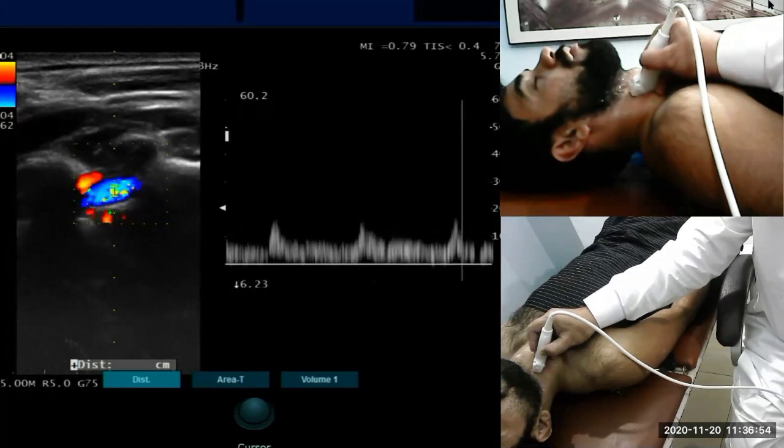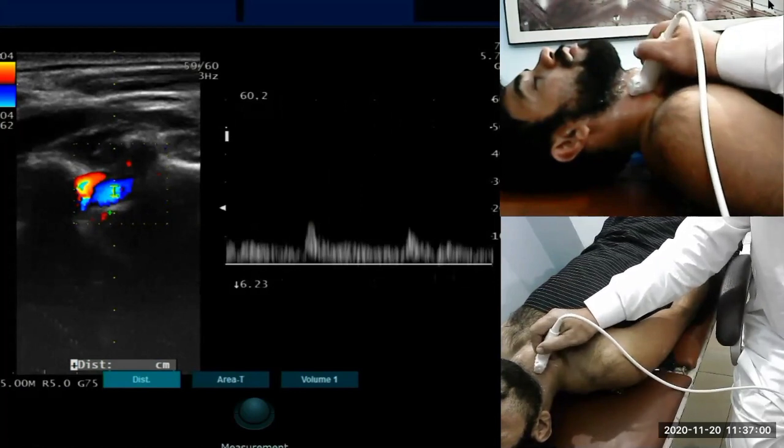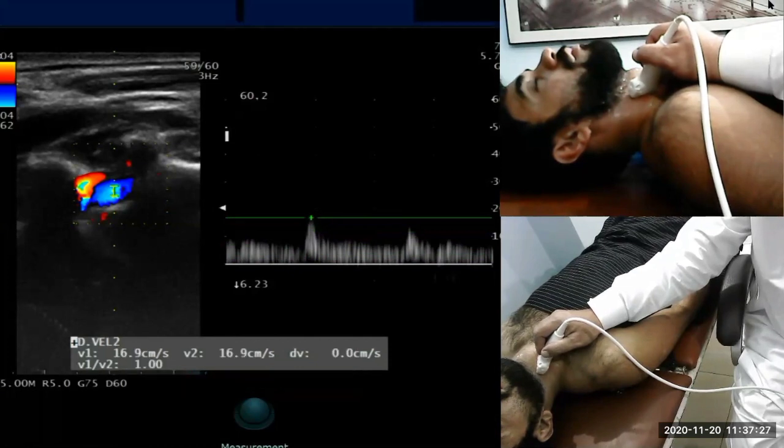So, my dear, just to check the systolic diastolic ratio, we will see this is peak systolic and diastolic here.